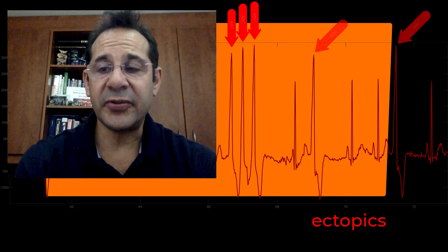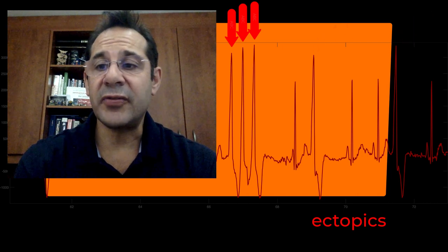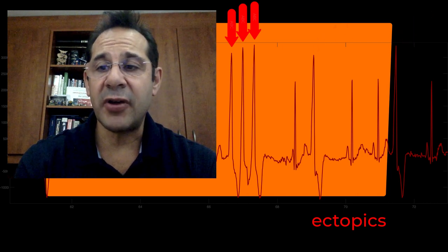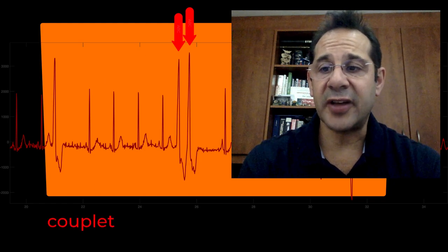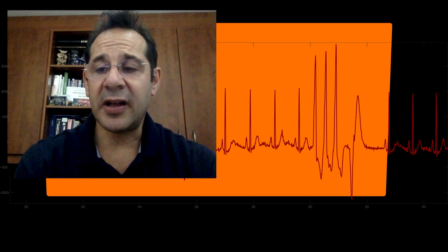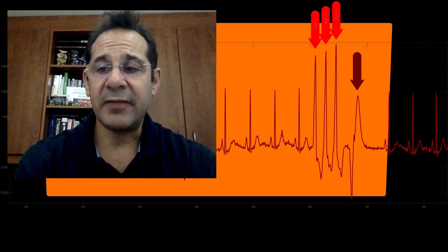On this tracing, there is also a run of three beats in a row from the bottom chamber of the heart, which is called a ventricular triplet. And also, there are two beats in quick succession from a separate site, known as a couplet. On the last part of the tracing, there's a run of three beats, and then one isolated broad beat from another region of the heart. These are all ventricular in their site of origin.